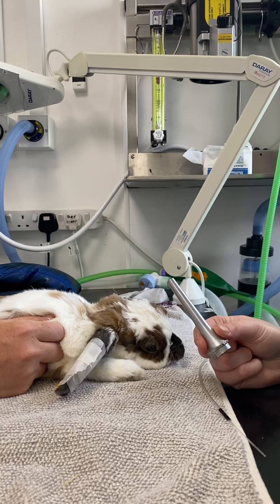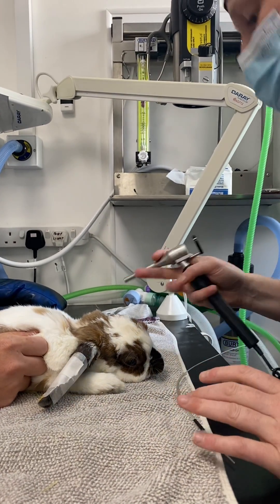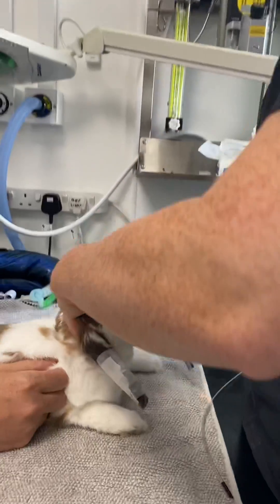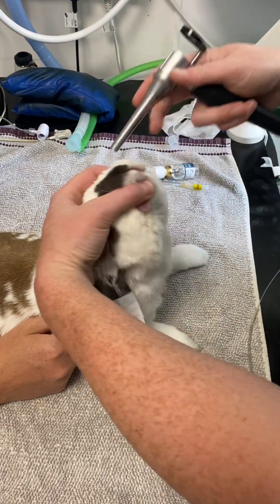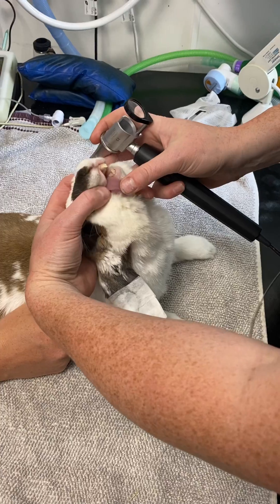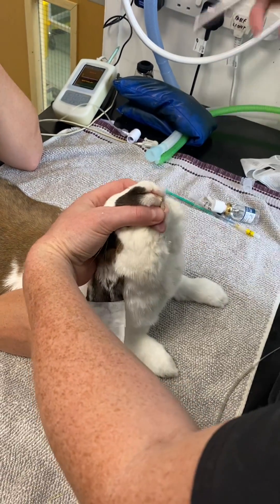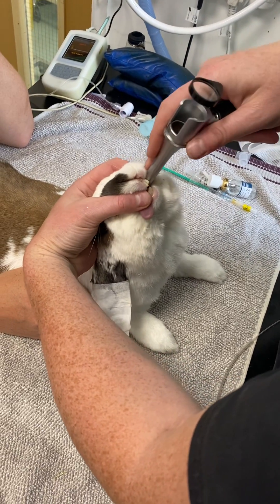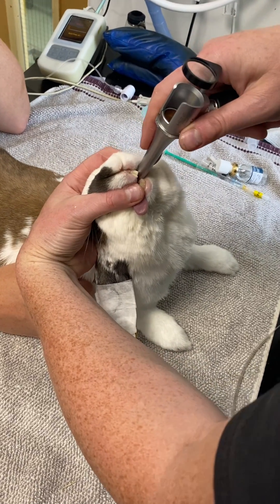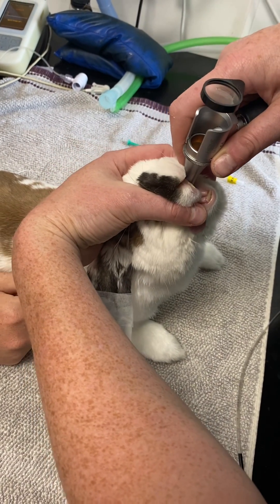Once the intubase is in place, we're going to use a long metal cone on our otoscope to visualize the epiglottis. I have the patient in sternal recumbency. I like to hold the head, though sometimes I get the nurse to help if it's particularly awkward. Exteriorize the tongue, but do not pull it too much as we're going to stimulate a cardiac arrhythmia — obviously the last thing we want. Then, using the otoscope cone, put it in the corner of the mouth and down the back of the throat.